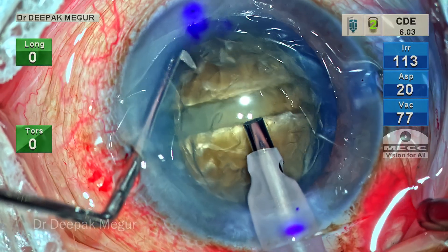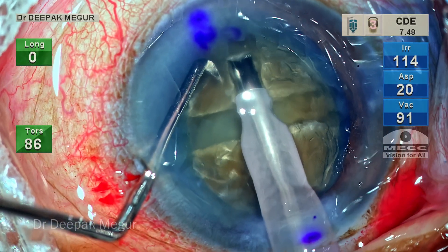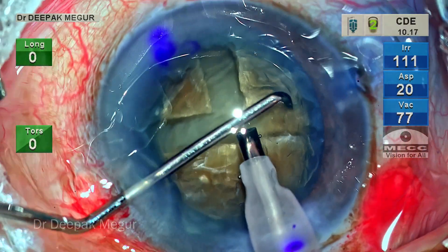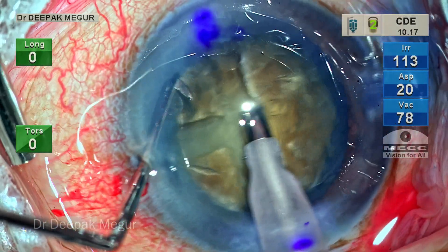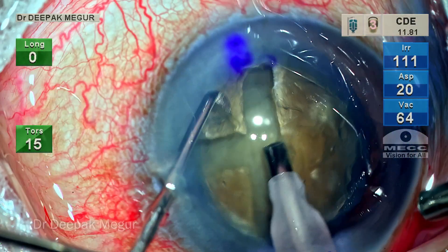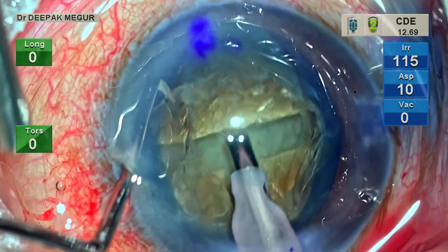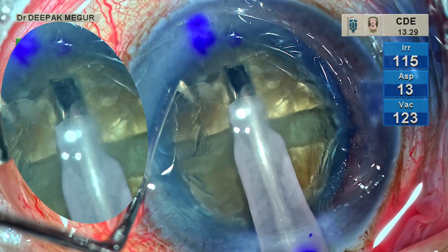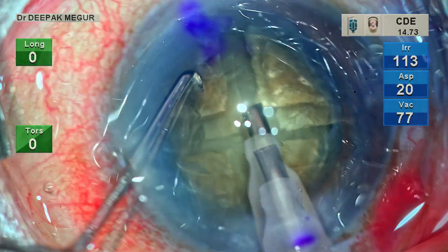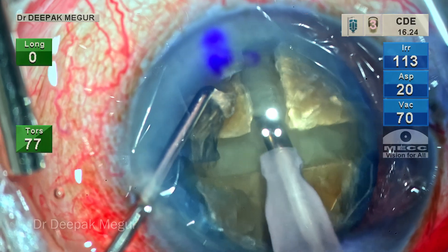The nucleus is rotated and sculpting in the quadrant 90 degrees to the original groove is continued. Once the depth of this new groove reaches that of the old groove, the nucleus is rotated and the distal part of the original groove is deepened. The last groove of the plus sign is now being created. I've exposed the tip slightly longer for better cutting efficiency and greater reach without obstruction from the sleeve.